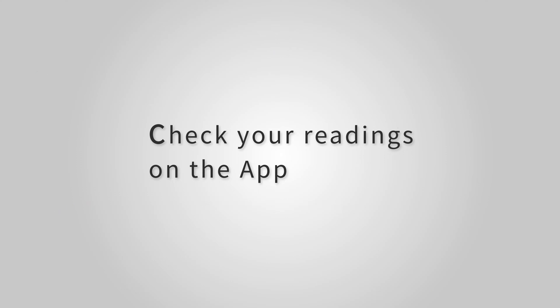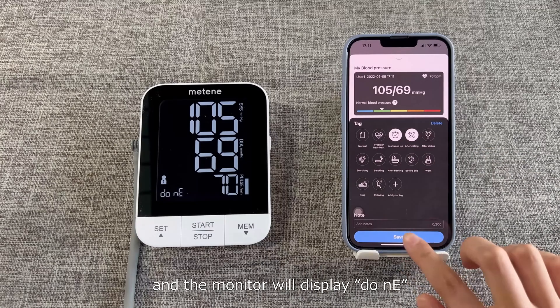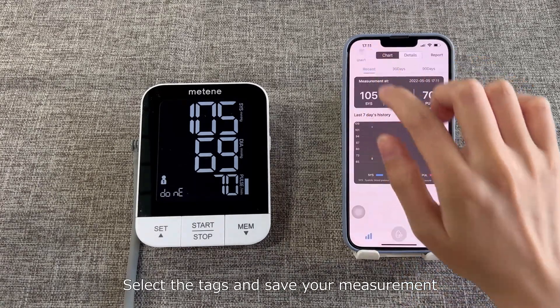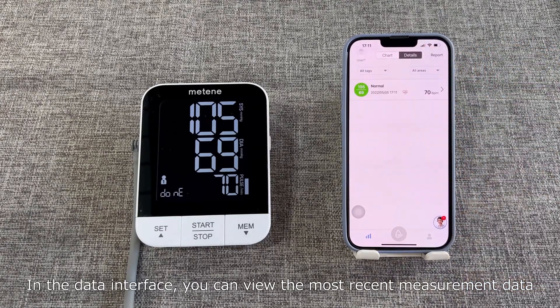Check your readings on the app. If the data transmits successfully, the monitor will display done. Select the tags and save your measurement. In the data interface, you can view the most recent measurement data.